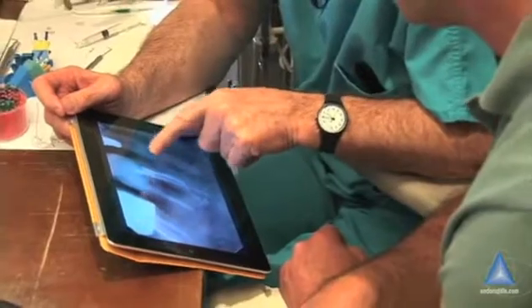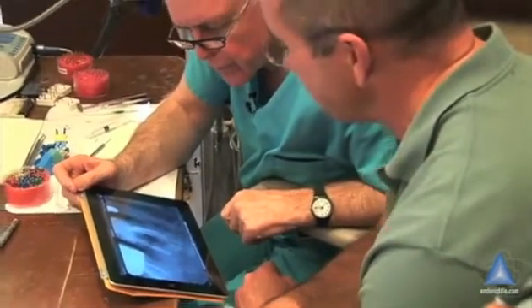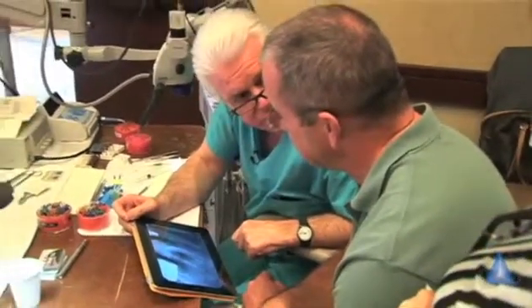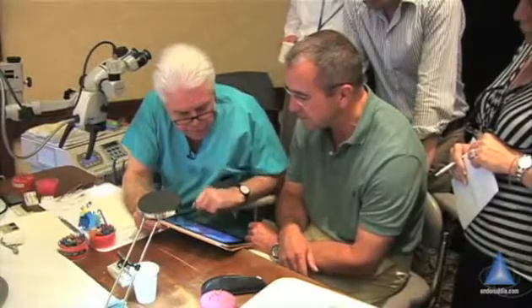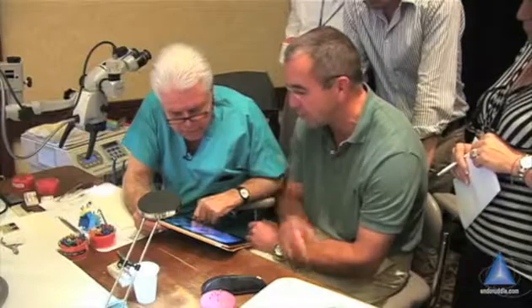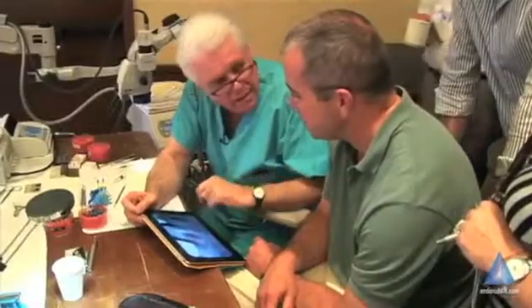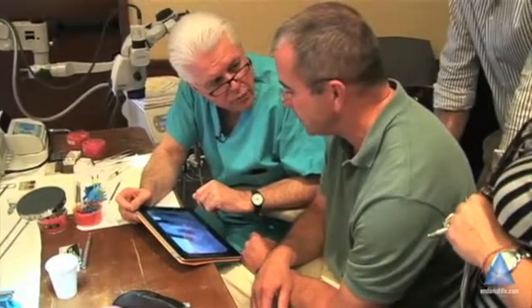And you have a little pocket here, so it probably comes down around like this. We'll see if this works. But no perfs inside the tooth. I bet it's your furcal canal. Is there perio around the mouth, or is it an isolated perio defect? Isolated. Then it's probably endo — it should heal.